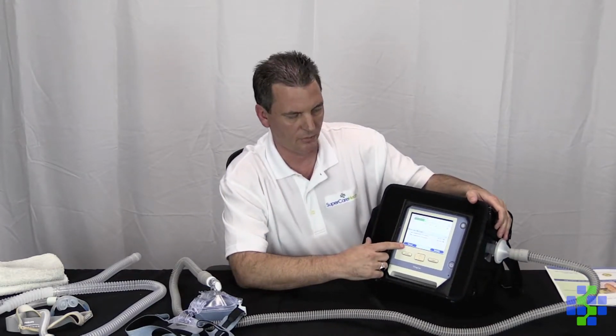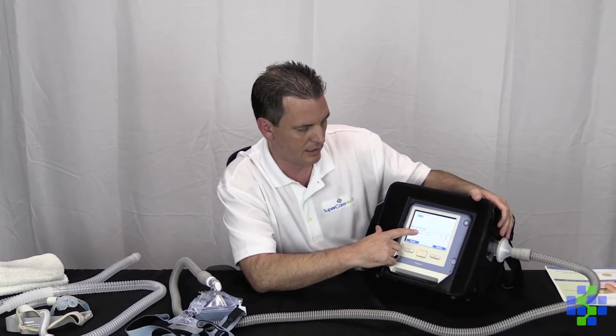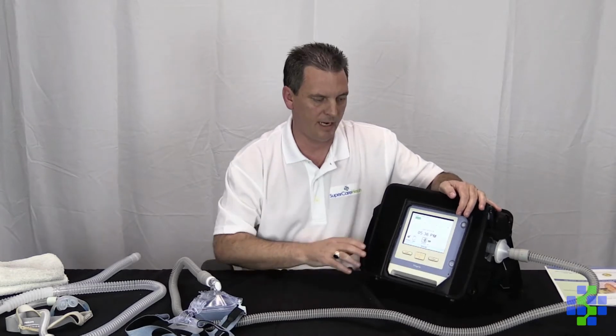And then we're simply going to hit the reset button. So it tells us what our alarms are here, so we can actually look and see, oh, there's a low inspiratory pressure. That's because we got disconnected. So I'm just going to hit the reset button, and it takes me back to my main screen.